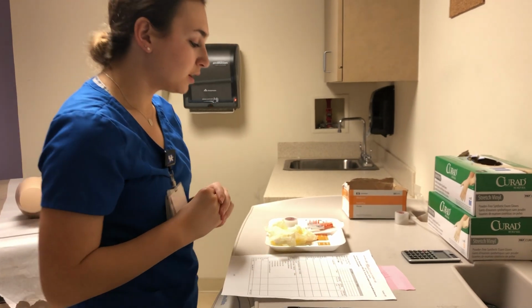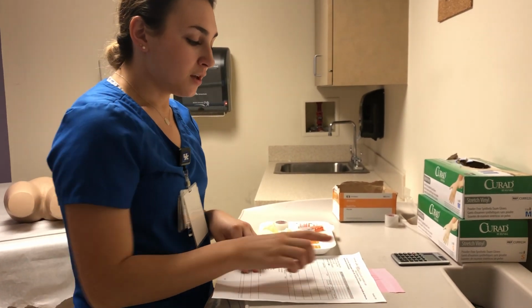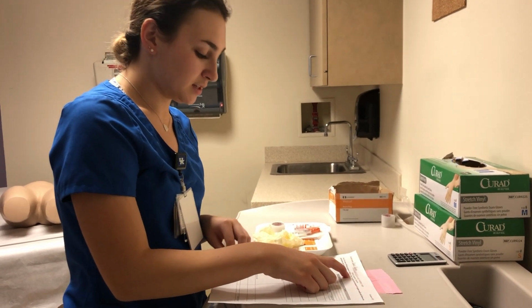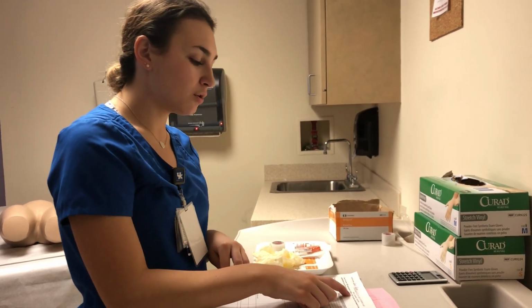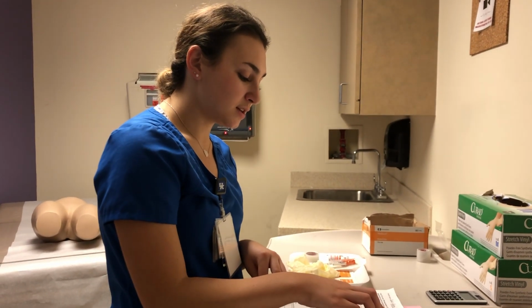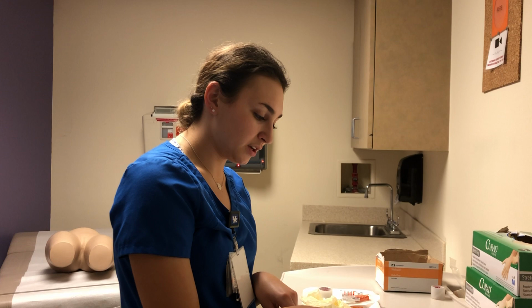So my med math has already been done for me. It does not need to be done in this particular case. So the units that we will be giving today is 6 units of regular insulin.